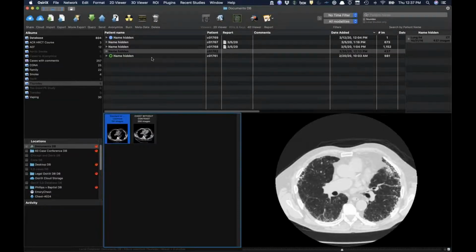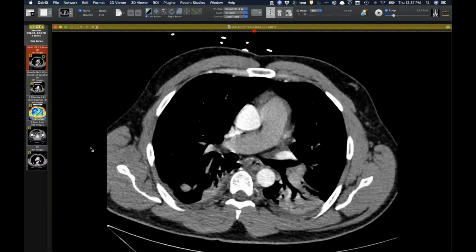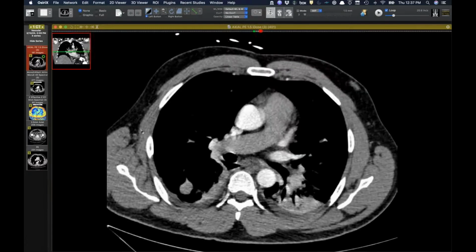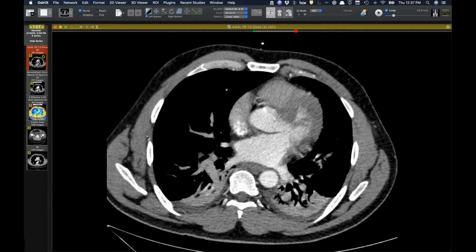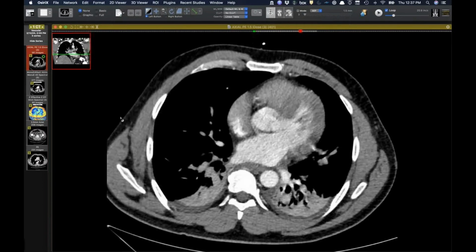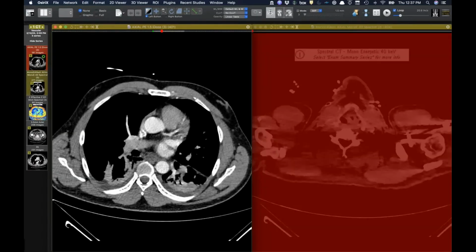And then this one really quick. So, this is a spectral CT, and we don't do that much dual energy. And Seth, do you guys do spectral CT too, or is it just dual energy? Well, spectral CT technically is only on a Philips. Yeah, and we don't have that. Okay. I'm a huge fan of it. I would love to get it, but yeah.